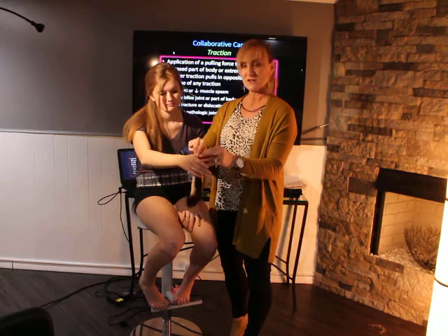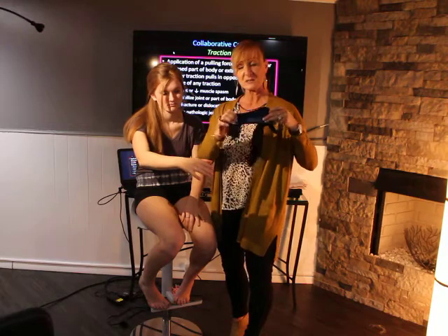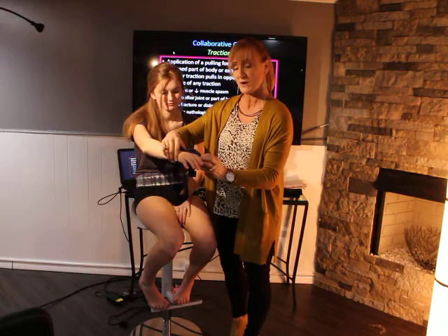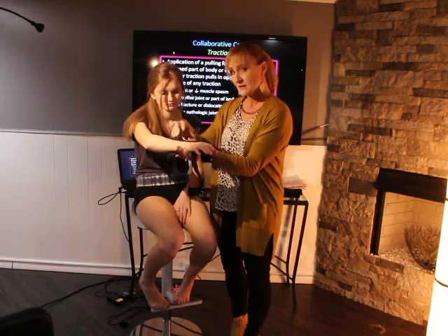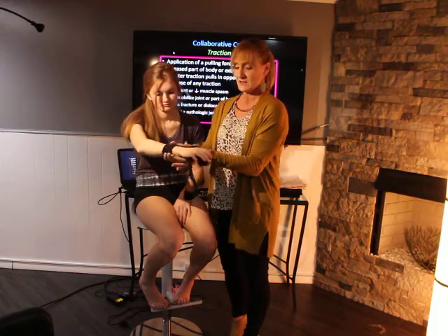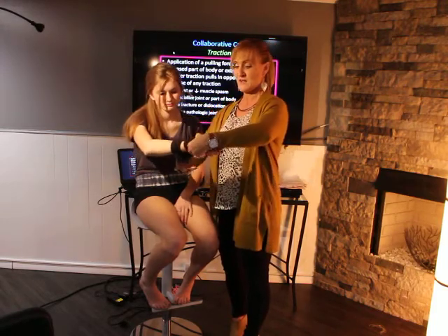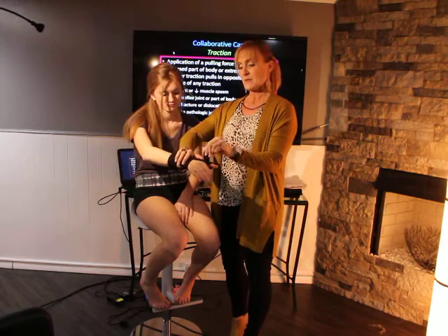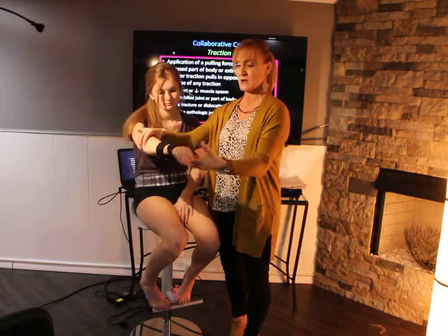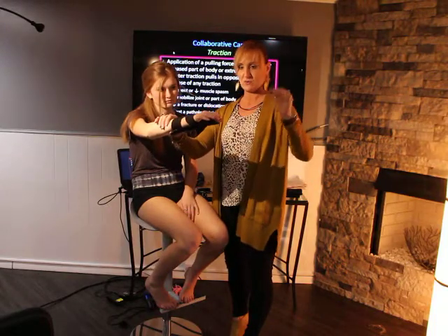So your patient comes in, joint is swollen, joint is tender. You can put a brace on that's going to be specific to that joint. So you're going to open it up, you're going to slide it underneath and right around on that wrist. You want it snug, but not so snug that it's going to cut off circulation. Most of them have associated Velcro straps, and basically what you're doing is you're just immobilizing this joint. Most of these braces are made for a specific body part. So now, for example, your patient who just has a thumb sprain can no longer move that thumb.